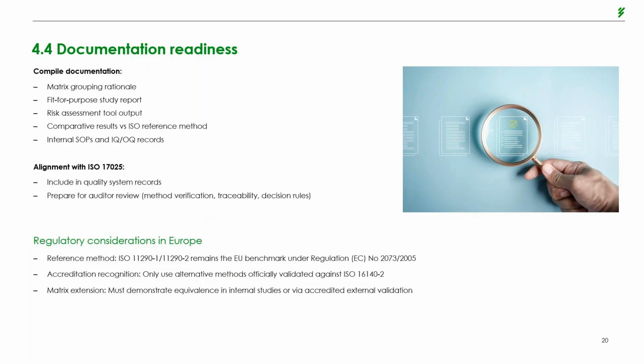Overall, even after going through these guidelines, we can appreciate the relevance of culture media even in just fast alternative methods, since the majority require and begin actually with an enrichment in a broth and then end by confirmation on a plate. The foundation again continues to be culture media.